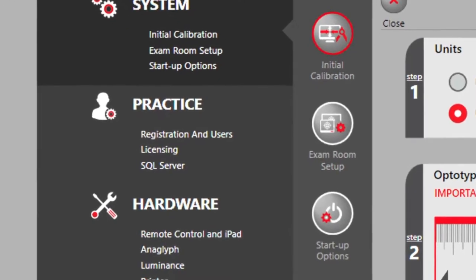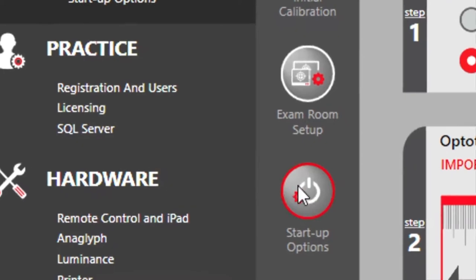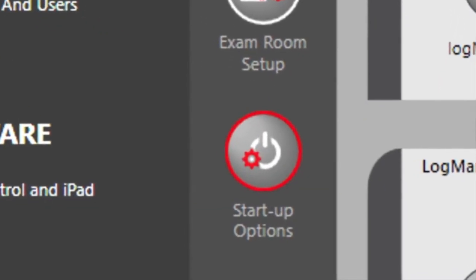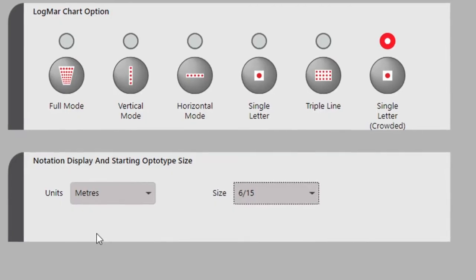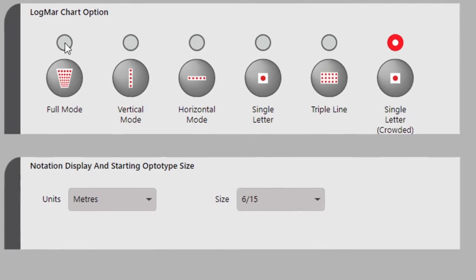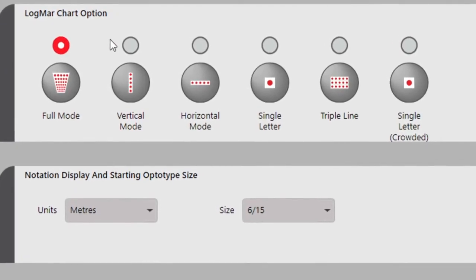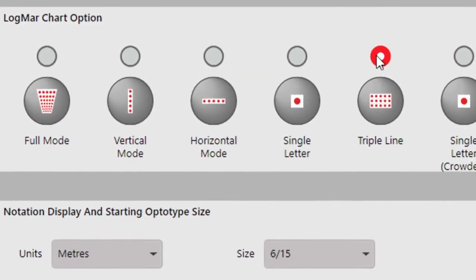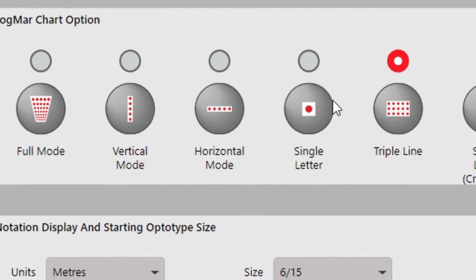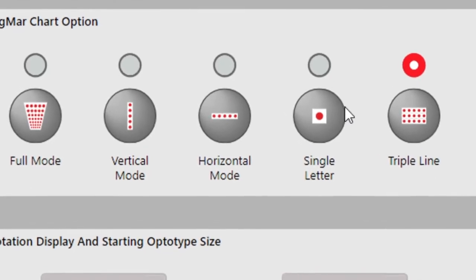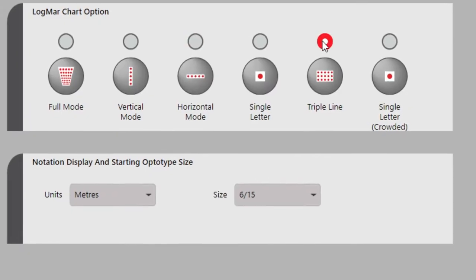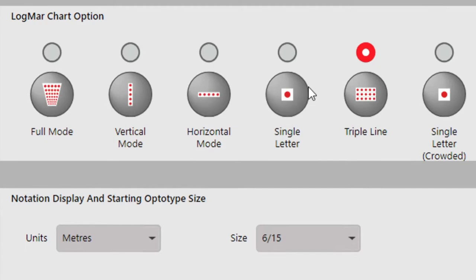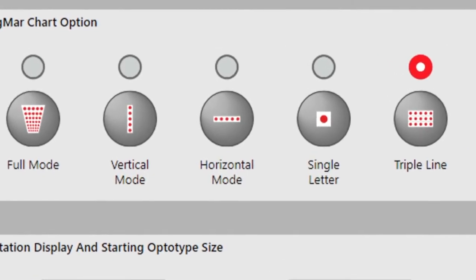Next, select Startup Options in the middle panel and choose your layout preference when displaying a letter chart. Most users select either the horizontal mode, which shows only one line, or the full chart. You can also select a single letter, a vertical row of letters, or a triple line of the same size letter.